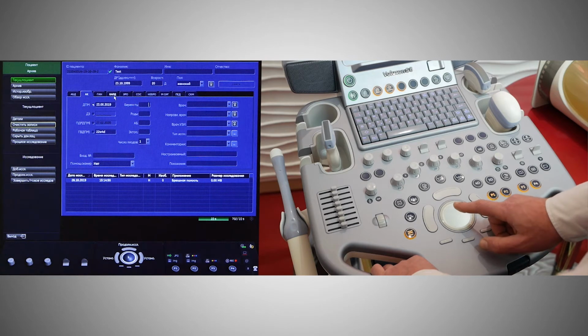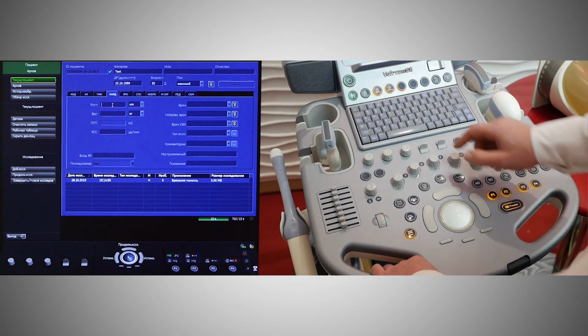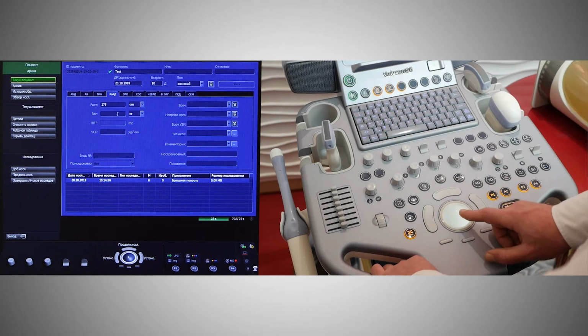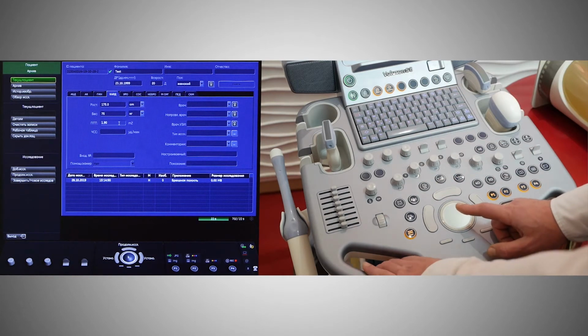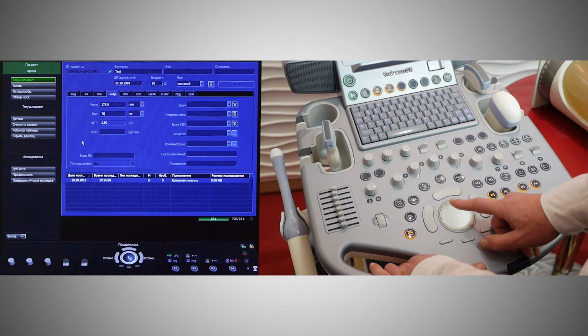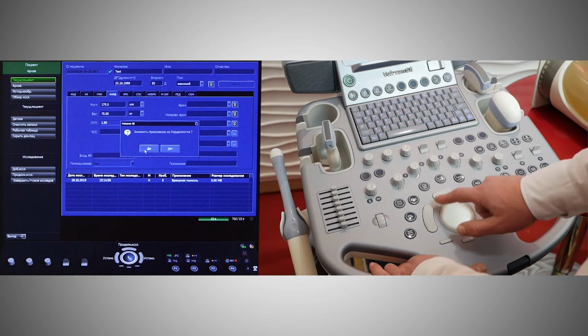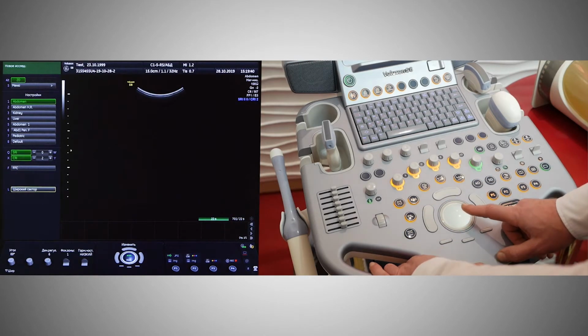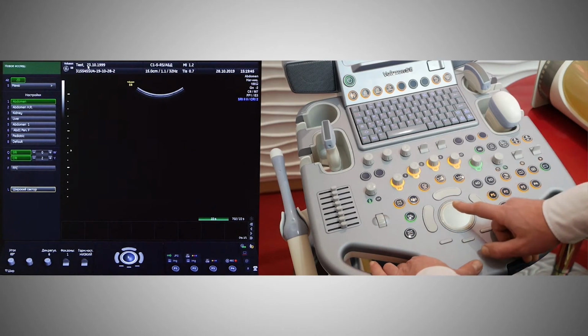If we are to perform an examination in cardiology, by specifying the height and weight of the patient, we will get the body area in square meters. After entering the data, we click Continue the examination. In this case, we changed it a little. And we already have it in the table. Well, the patient's last name and date of birth are indicated on the top lines.